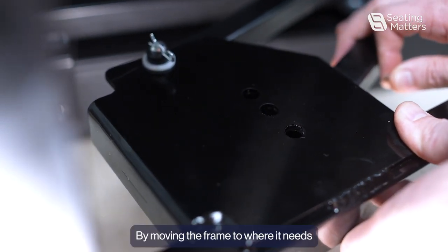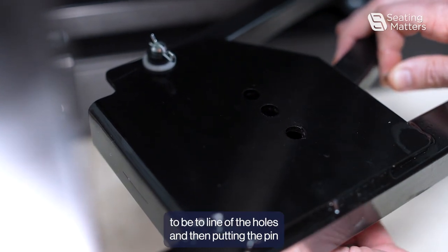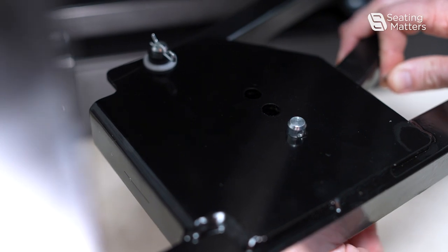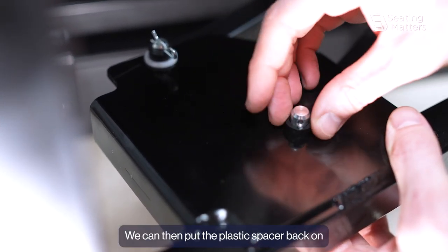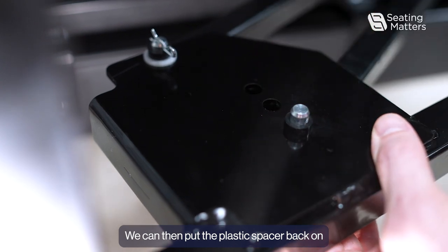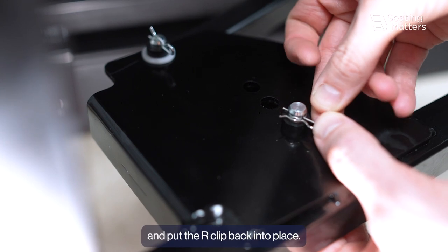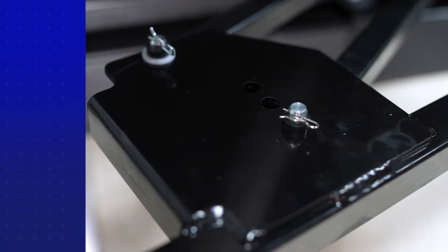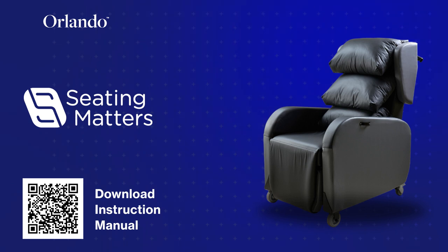By moving the frame to where it needs to be, lining up the holes, and then putting the pin back into position. We can then put the plastic spacer back on and put the R-clip back into place.